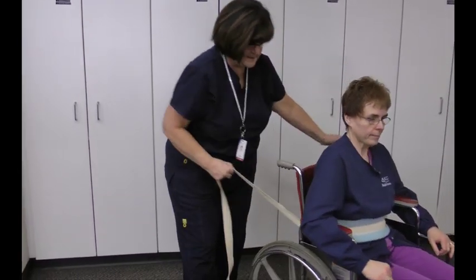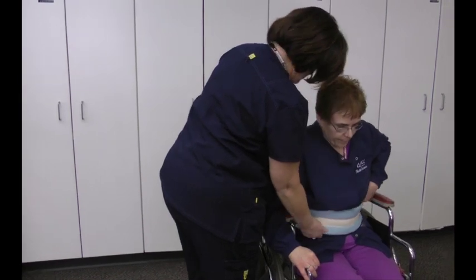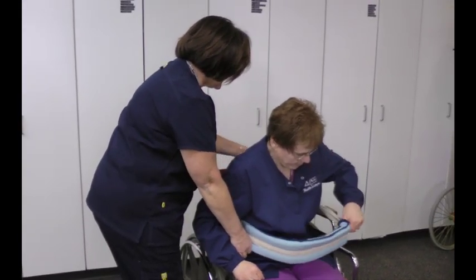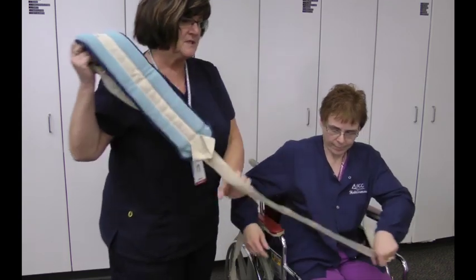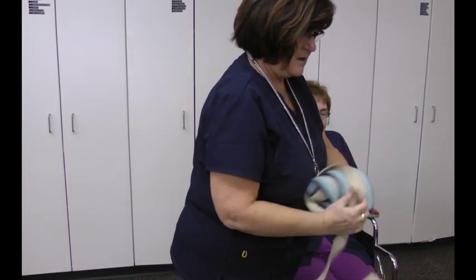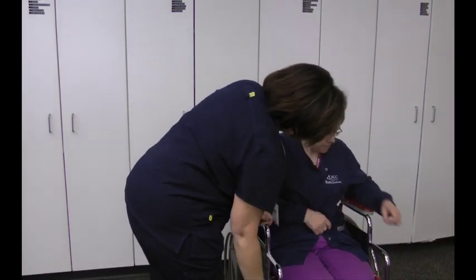I'm going to go ahead and take this off. Remember, the rules are when someone has a restraint on, you have to visually see them. Every 15 minutes, check on them, and then you need to release them and reposition them. So one of the things we've taught is that we could lock this wheelchair.